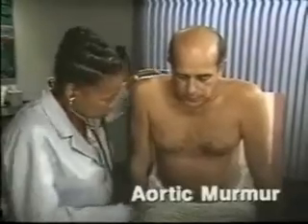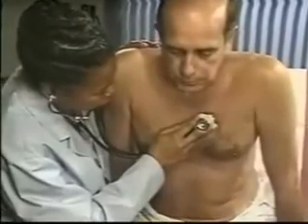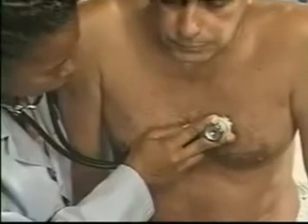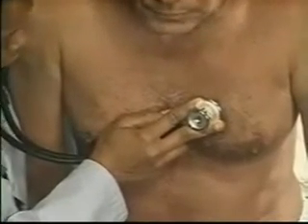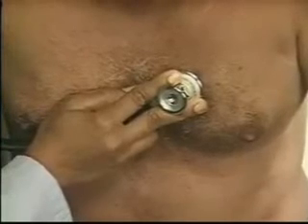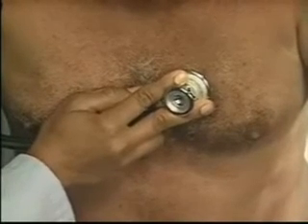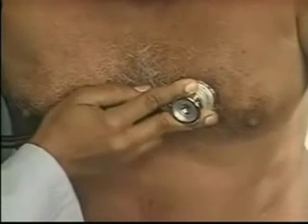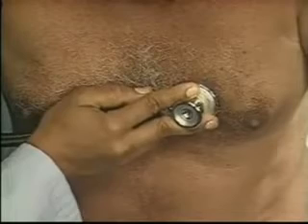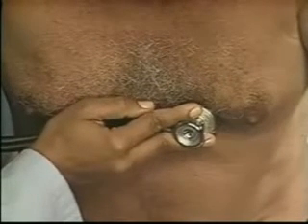To help detect aortic murmurs, especially that of aortic regurgitation, have the patient sit up and lean forward. Then ask him to exhale completely and hold his breath out. Using the diaphragm of the stethoscope, listen at the left second interspace and down the left sternal border to the apex. Breathe out completely again and hold it. Pause periodically to allow the patient to breathe. Listen for the high-pitched diastolic murmur of aortic regurgitation. If the patient had this murmur, it would sound like this.